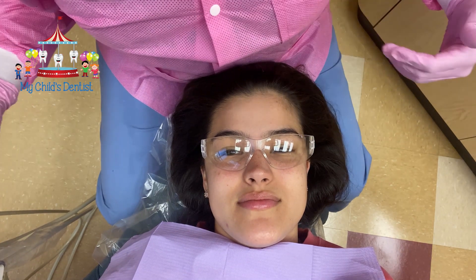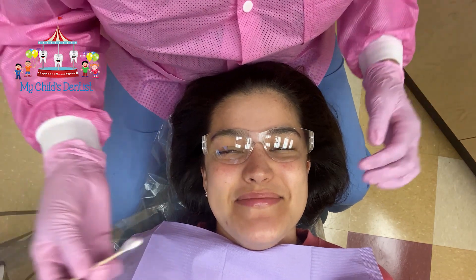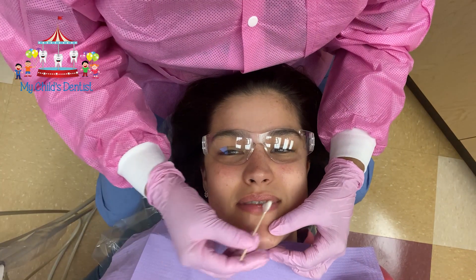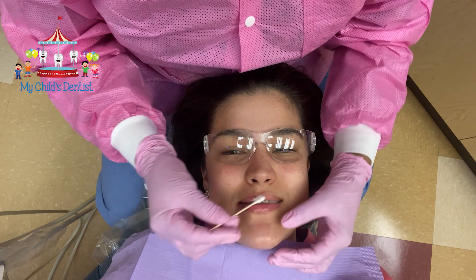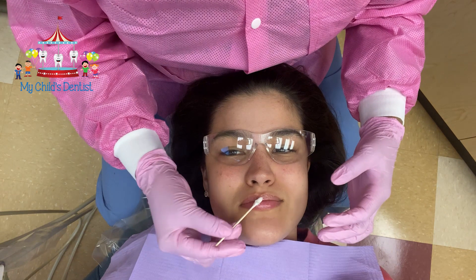So the first step when we have our patient in the chair — we're going to say hi! Hi Gabriella, we're so happy you're here. I'm going to place a little bit of Vaseline on Gabriella's lips because I am going to apply a little bit of stain on her teeth.